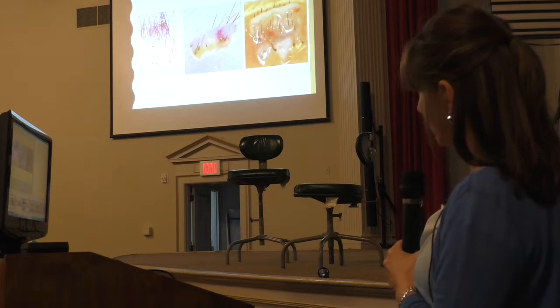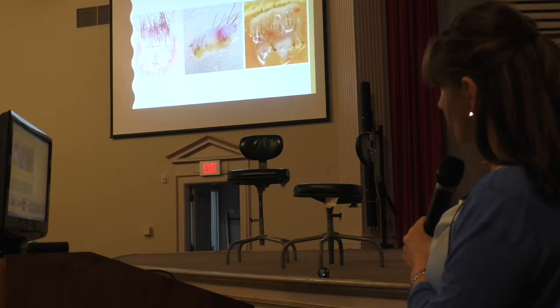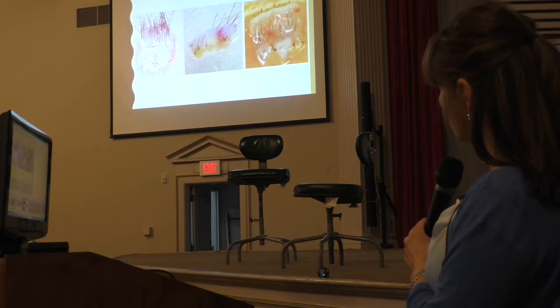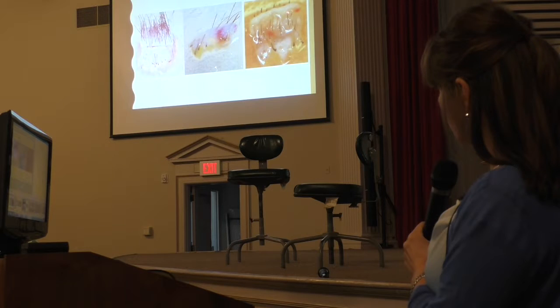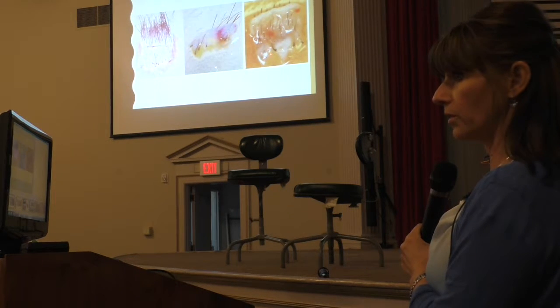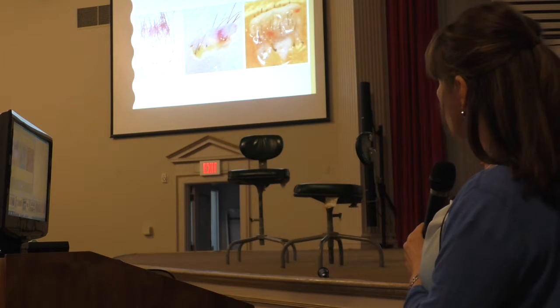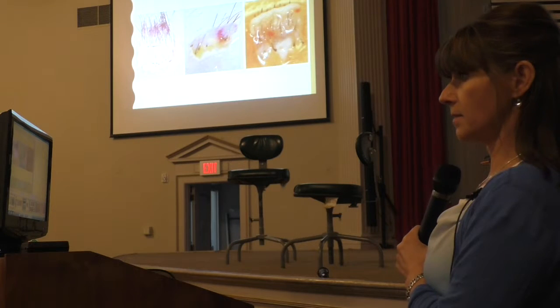When I make a sliver out of this piece, this is what it looks like when I see transection on this side of the sliver. So if you see the difference, the transection on this side of the sliver means the assistant made it while slivering our tissue. So understanding what you see and what that means is important.